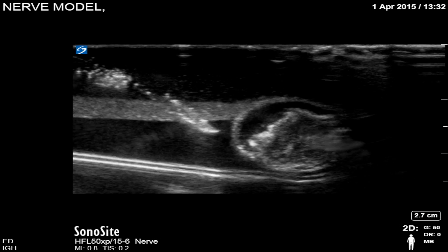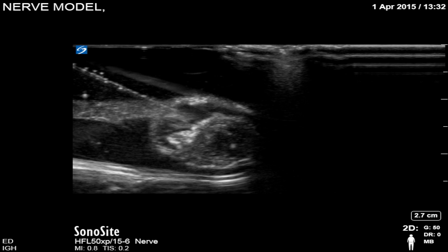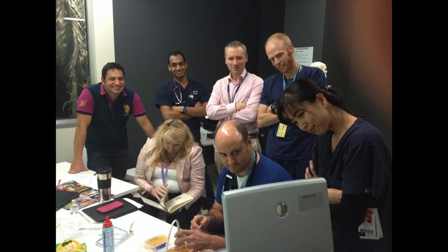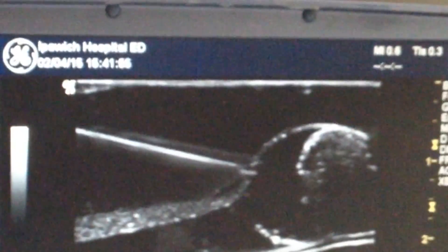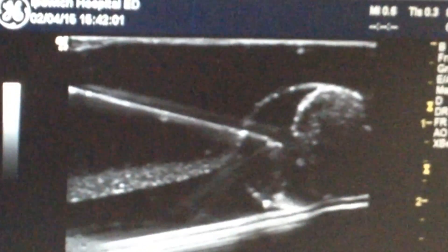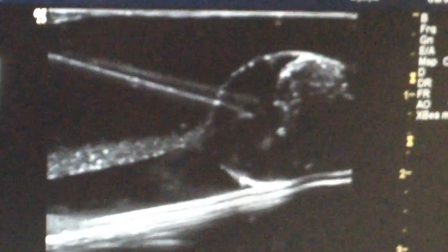As you can see, it gives us a reasonably realistic pattern. You can see when you're injecting in the right place the balloon expanding. You can eventually start having competitions to see who can make their raisins flip. You can also learn to direct the needles to the back of the nerve and eventually have the nerve surrounded by your injection.